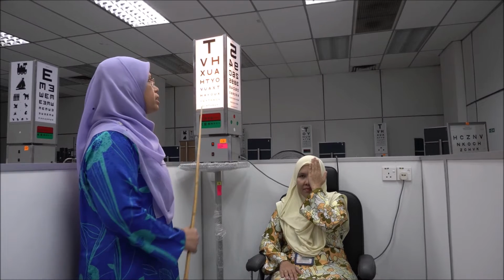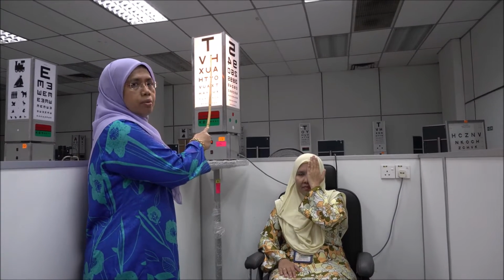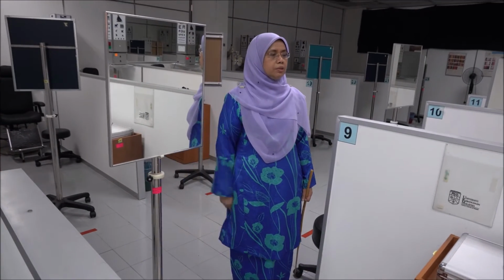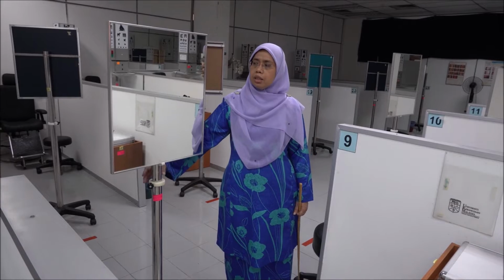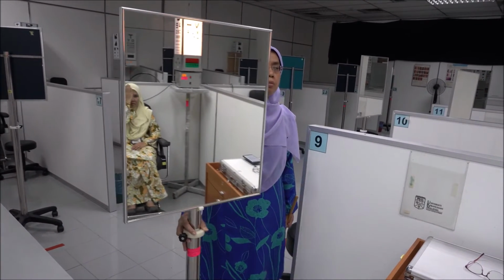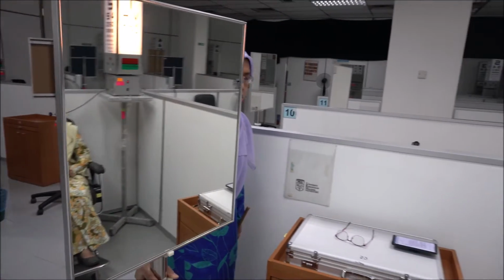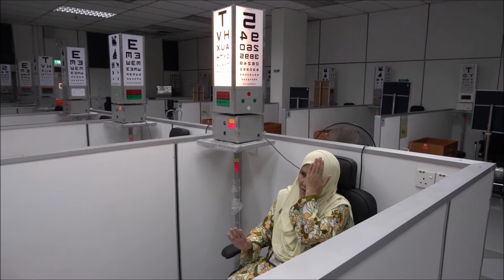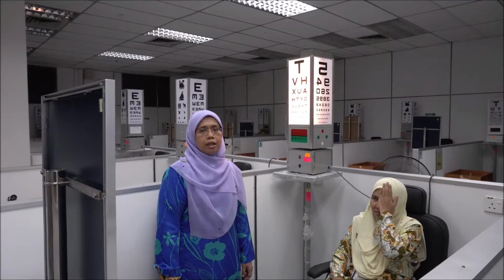Now, if the patient cannot see the top letter, we have to move the mirror closer to the patient. Move the mirror closer to the patient until the patient can see the top letters on the Snellen. Okay? And now we ask the patient to read the letters on the Snellen chart at a distance of less than 3 meters.